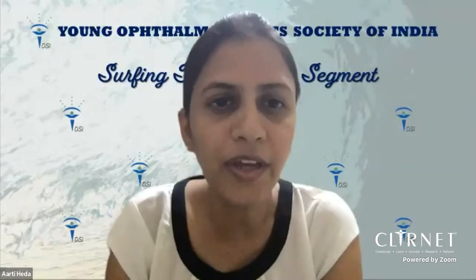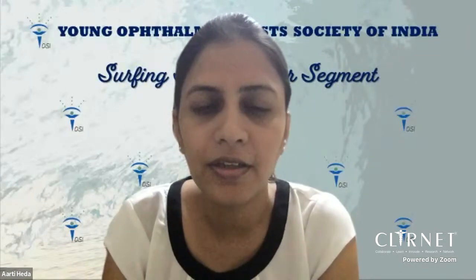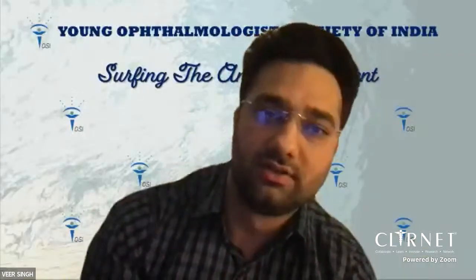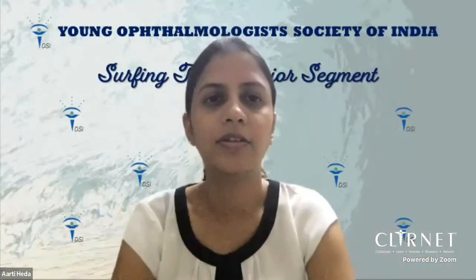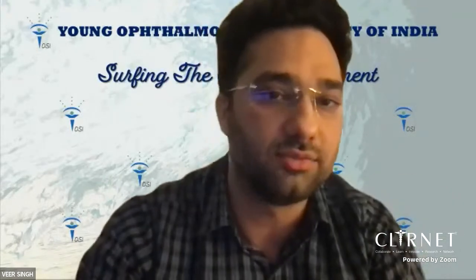Okay, sir. So do we have any more questions for Harshul sir from the audience? Can I just add to that as well? Yeah, please, Dr. Veer, go on. Yeah, so I think sir has beautifully shown his videos as well. As soon as you notice the PCR, usually your phaco handpiece is inside and the chamber is maintained. So try to quickly take out the nucleus as much as possible. If a piece goes down, no problem. And right after that, leave the cortex, don't go after the cortex. That's when you inject triamcinolone, basically, as soon as you've taken care of the nucleus.